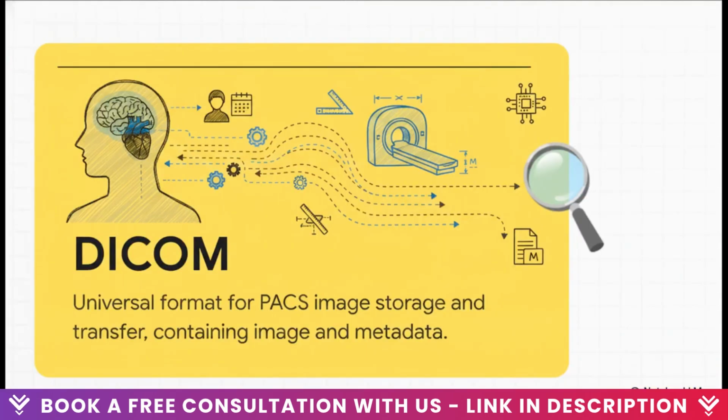So this is where we actually capture the data, using modalities like CT scans, MRIs, and X-rays. Now, in the consumer world, you and I are totally used to JPEGs and PNGs. But in healthcare, we use DICOM, digital imaging and communications in medicine. And a DICOM file is incredibly complex. It's not just a flat picture, it's this robust file packed with critical clinical metadata. So it contains the image itself, for sure, but also the patient's age, the specific settings of the scanner, the physical dimensions of the pixels, even the slice thickness of an MRI. This metadata is truly the lifeblood of a hospital's imaging network.